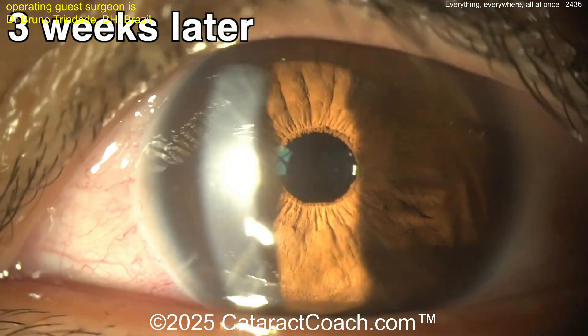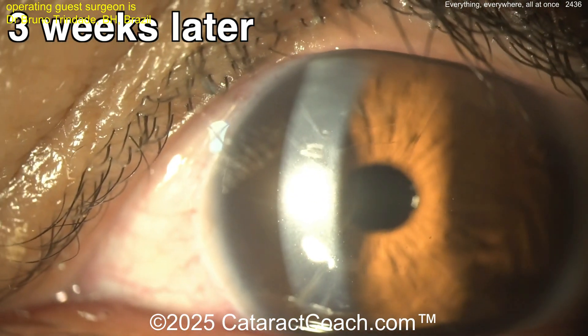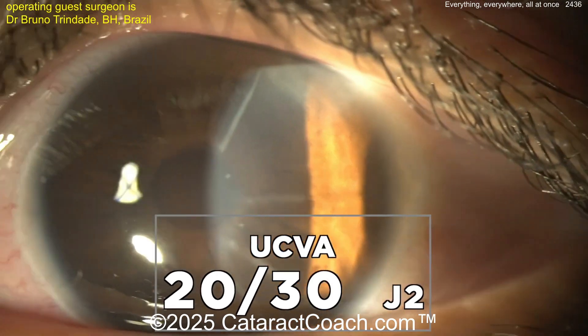Then let's wait — give this patient about a month or so. Right there you can see the pinhole implant, beautifully centered. Three weeks later — wow, look at the cornea, it's totally clear. Pinhole implant in good position, toric lens also in good position.